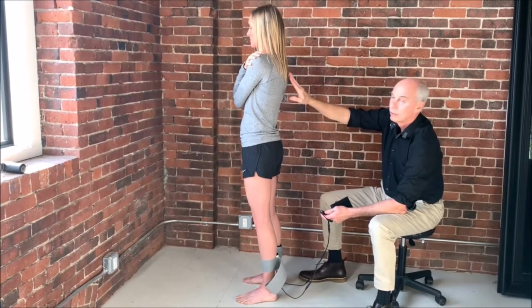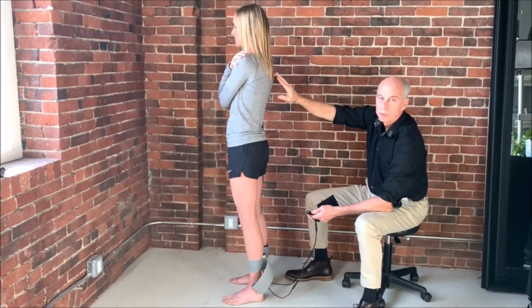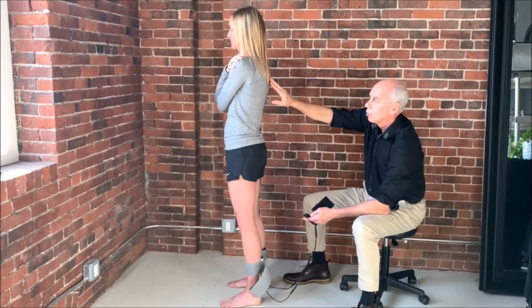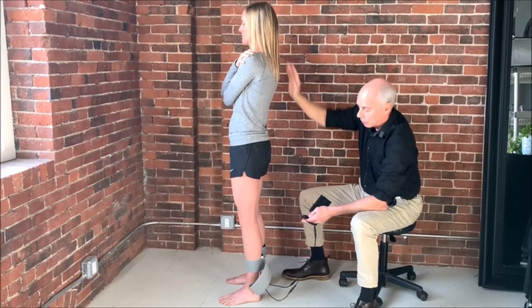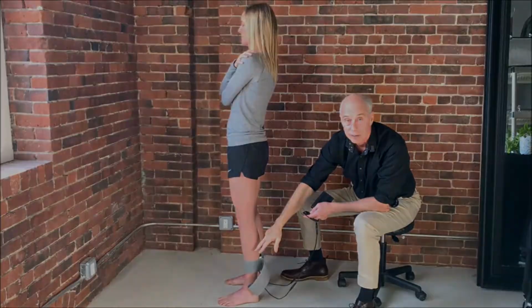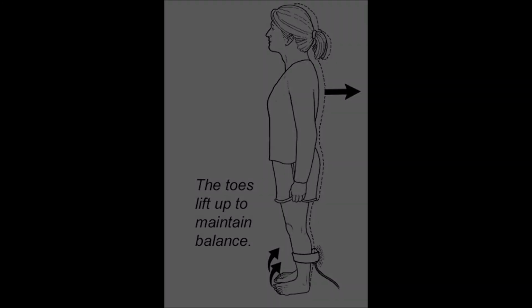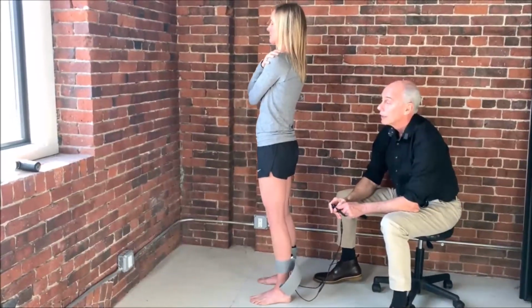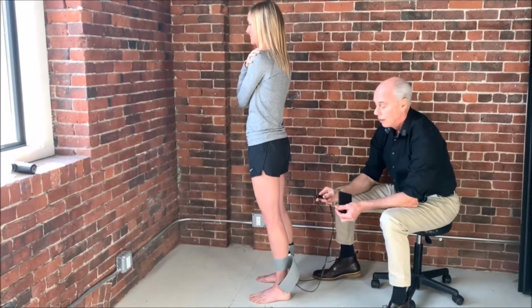See, when I turn it off, she went forward. Kim has good core proprioception, so she only moved like 1.5 centimeters. I'm going to turn it on again. People with poor proprioception, let me have you exaggerate it, they'll come back like this. They'll come back so far their toes lift off the ground. This test takes 20 seconds to do, and it predicts future injury. You are 4 times more likely to be injured in the future.